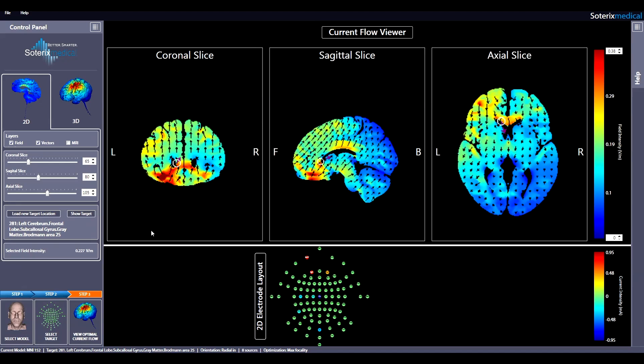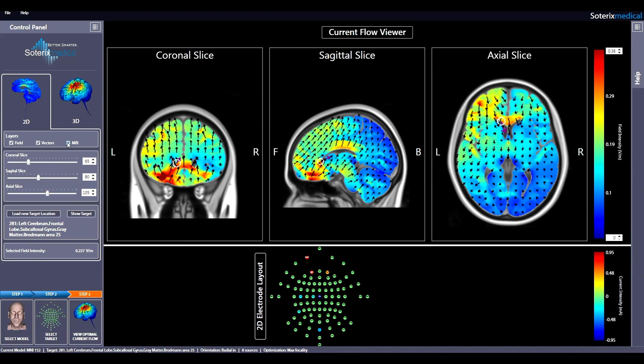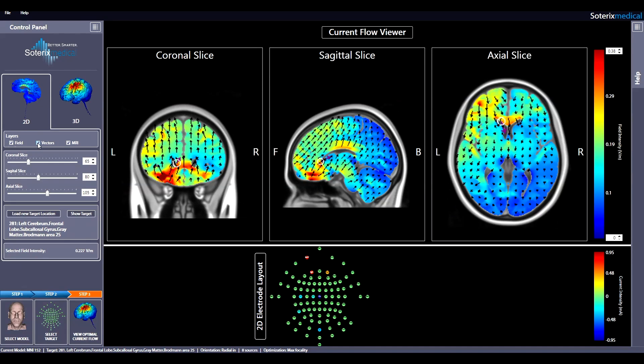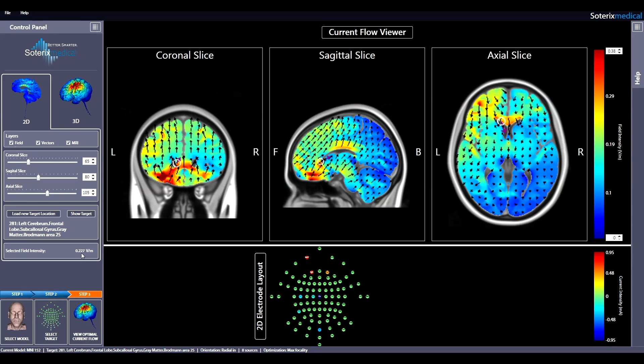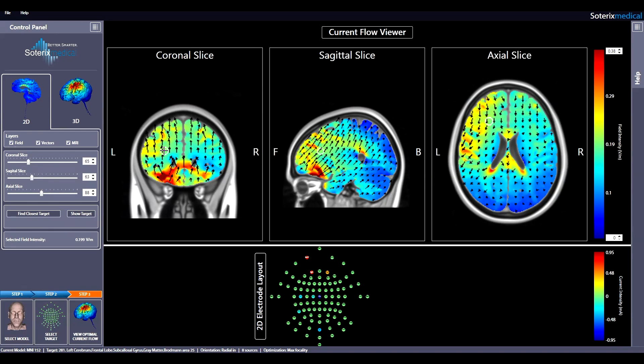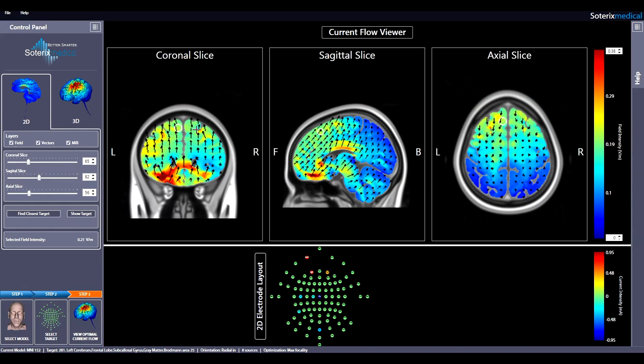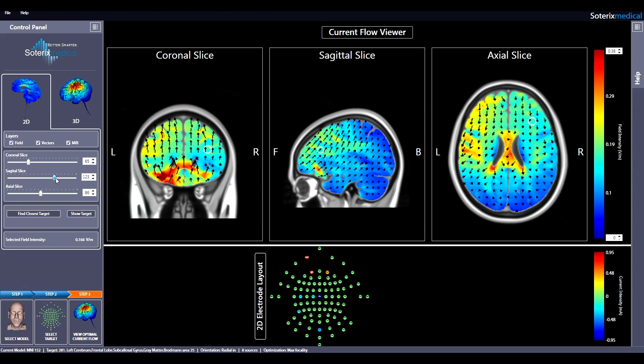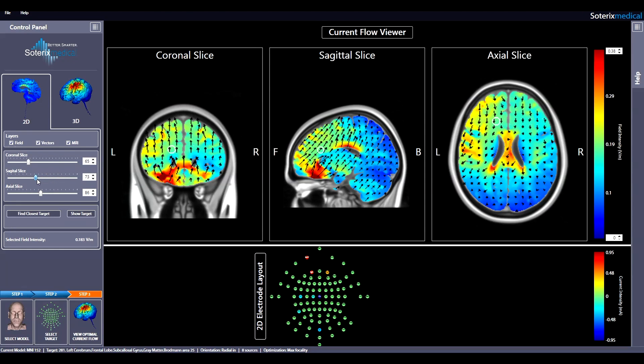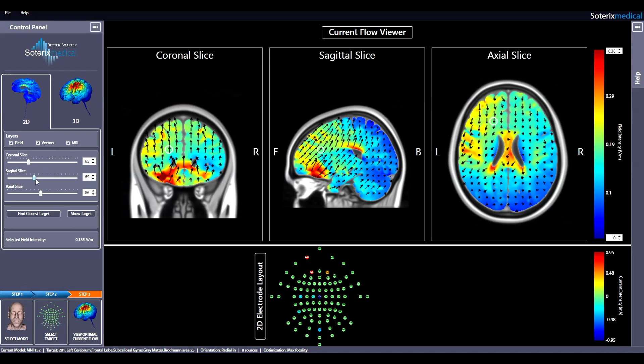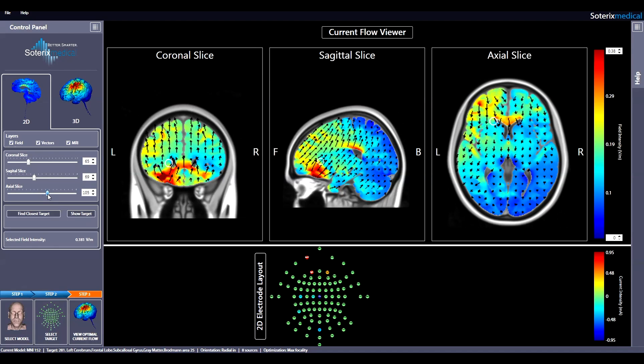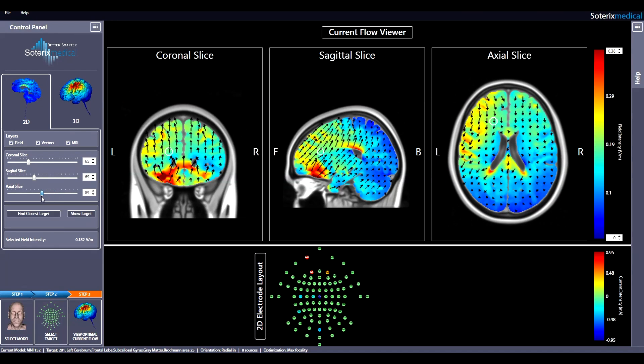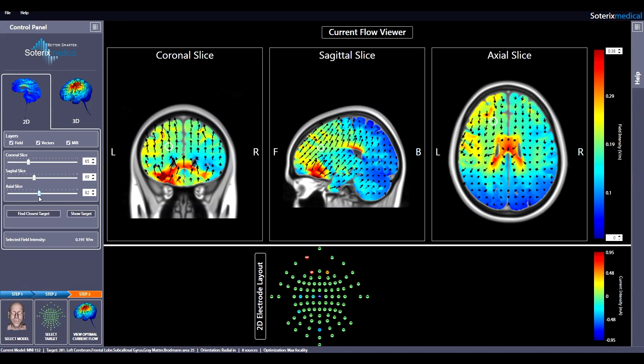You can select to view the subject's MRI. You can also toggle the current direction vector and toggle the electric field or a view altogether. The selected field intensity value in the control panel shows the field intensity inside the open white circle at the target location. An electric field of 0.227 is induced at the desired target. You can navigate through the head by simply clicking around in the 3D space or move slice by slice at 1mm resolution by using sliders in the control panel. The selected field intensity value will constantly update, always showing the field intensity inside the open white circle. You can use this feature to determine the field at any voxel on the head.